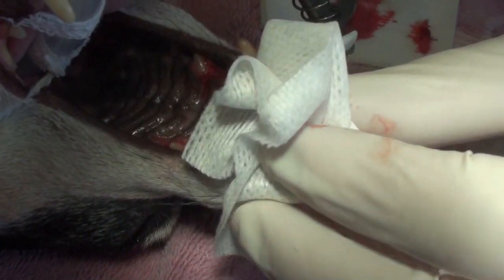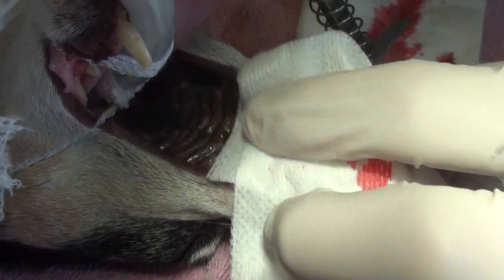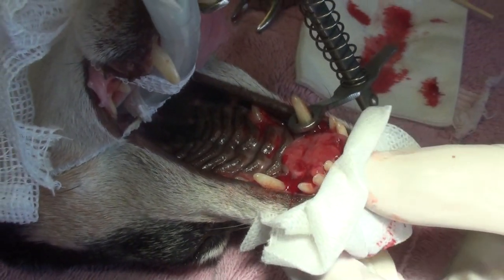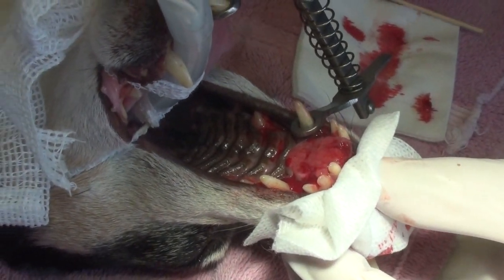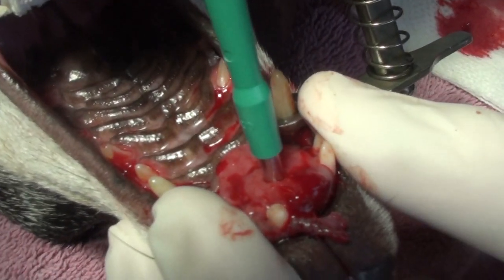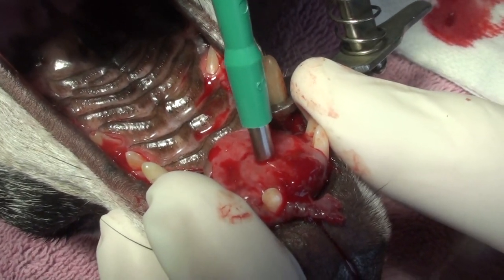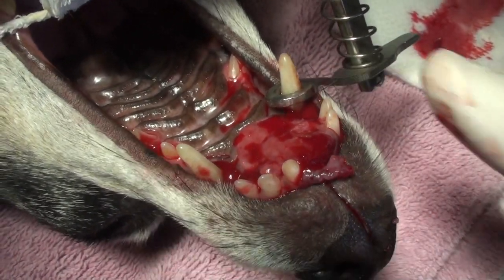Maybe I'll nip off that little rostral piece right there. It's already going to fall off where the tooth was. The instrument has a sharp edge and you put it right into the tumor — it's a round circle.